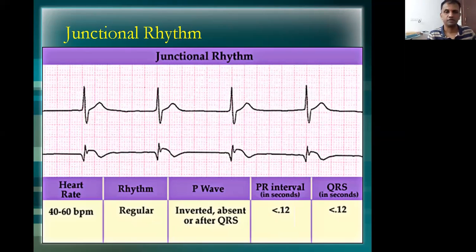Sorry, it may be difficult to show it on this one, but with an ECG trace, if you draw a line with a white paper and move it forwards, this will correspondingly follow the same level. There won't be any falling before or falling afterwards.